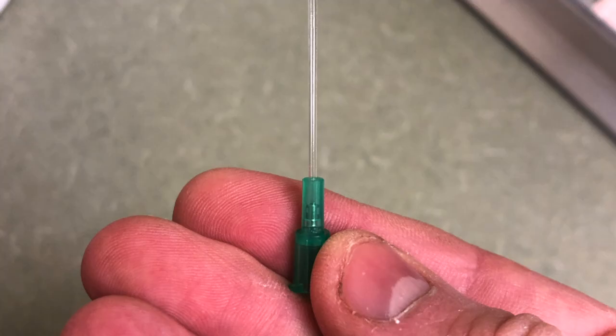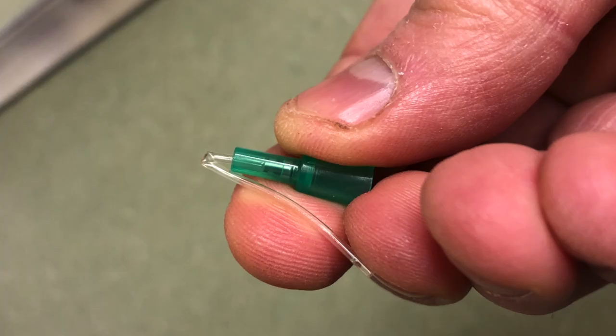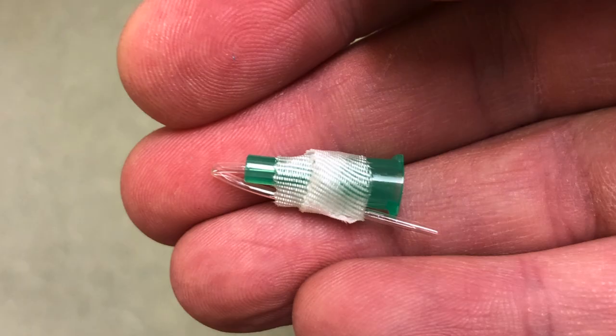Procedure. Making your own atomizer is easy. First, you just take an 18-gauge angiocath like this, and then fold over the plastic catheter like this. Wrap a narrow strip of tape around it to hold it down.